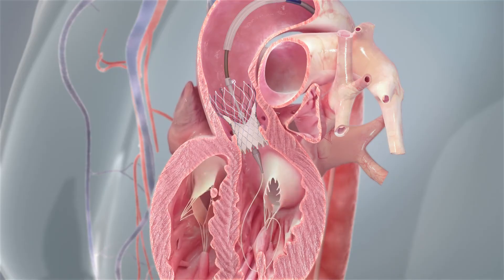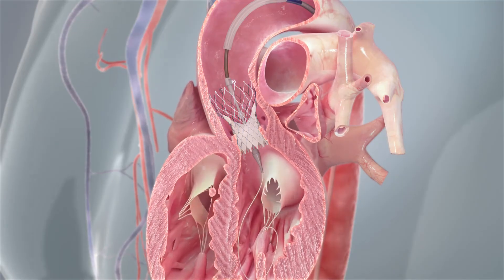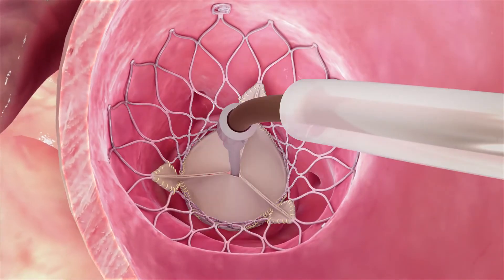One moment you have a stenosed valve and the next you have a fully functioning heart valve working perfectly.